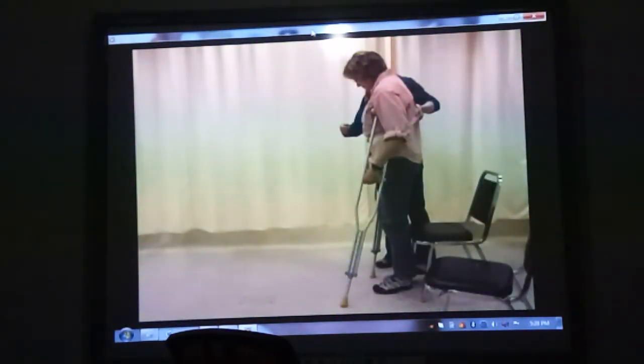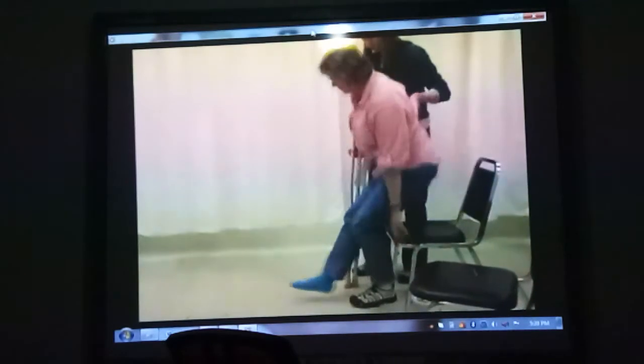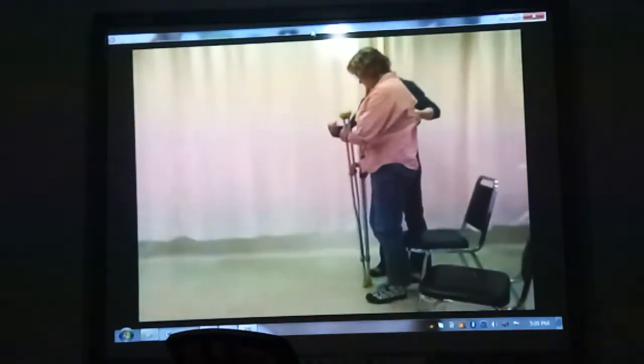The patient establishes balance and uses the left hand to place one crutch in the left axilla. The remaining crutch is placed in the right axilla using the right hand. Okay. And push off with your other hand. Remember, no weight on that leg. Okay. 1, 2, 3. Now swing that one crutch underneath one arm.